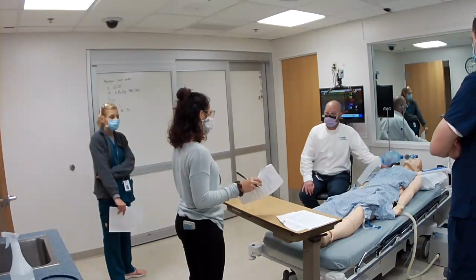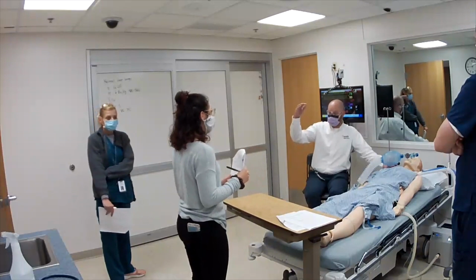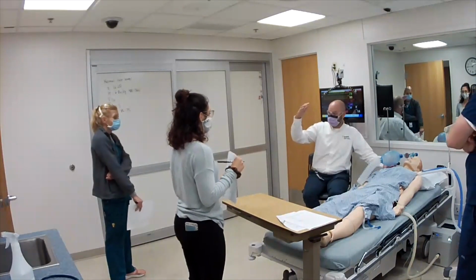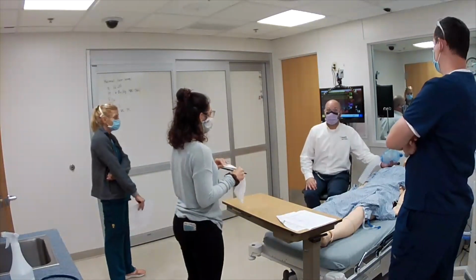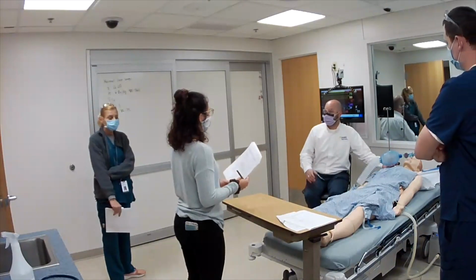Because then they're not going to get 560 of volume if they air trap. They're only going to get that. So when you start getting up north at some of those pressures, that's a little safer. What else? What is another good time to use it? There's one unit in the hospital that uses pressure control a lot.